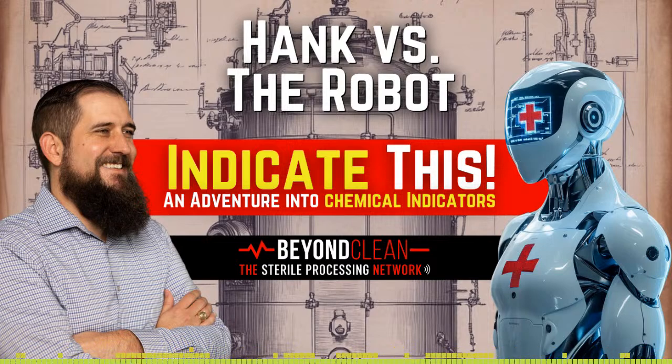The substrate is coated with a chemical formulation that reacts to specific conditions in the sterilizer. For indicators, this might be a simple dye that changes color when exposed to a certain temperature or the presence of steam. For integrators, the chemistry is more complex. They're designed to respond only when the conditions meet a combination of factors like time, temperature, and sterilant concentration. Manufacturers calibrate these products to strict performance standards, often set by organizations like AAMI or ISO. For example, integrators must mimic the behavior of biological indicators, which means testing their response at various stages of sterilization cycles to ensure they're accurate and dependable.